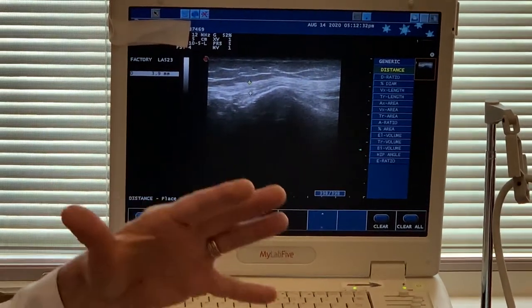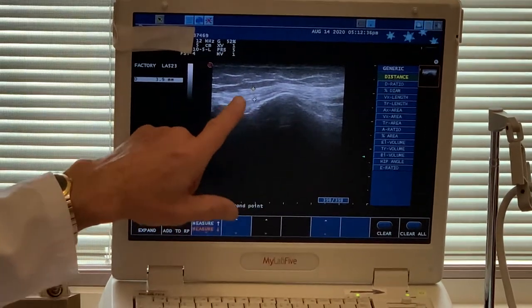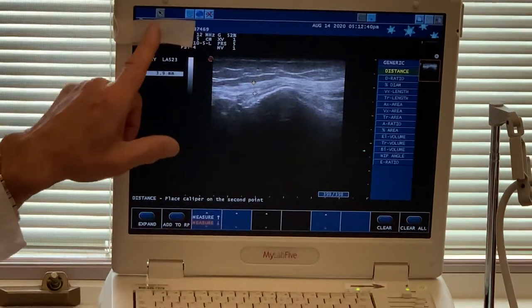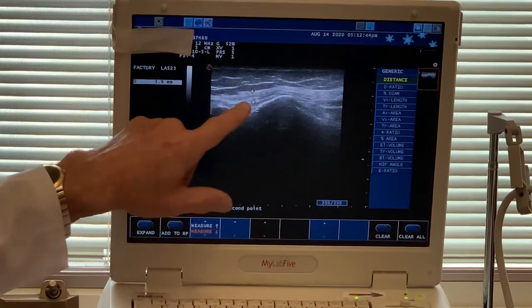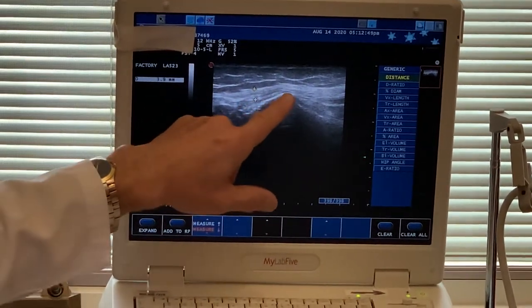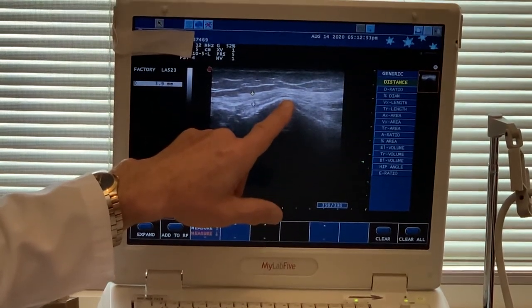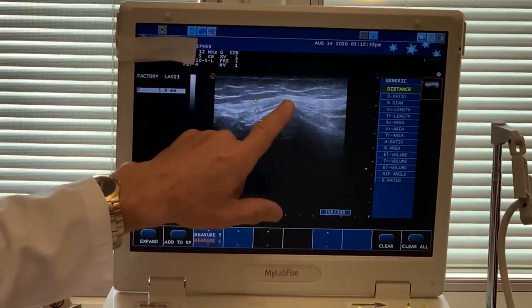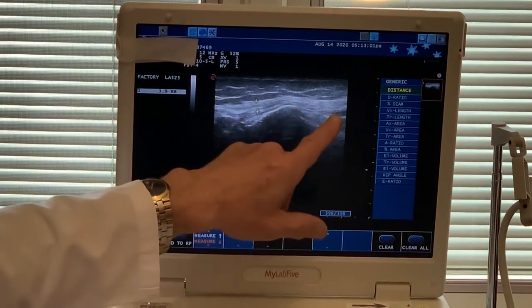I call this the napkin ring effect, or maybe the hourglass effect. You can see here — I've already measured this area — the diameter of the nerve is 3.9, and back here I think it was around 2.7 or 2.9. So you can actually see it's very thin, and then you come out here and it bulges — it's thicker. You can see the same phenomenon here.